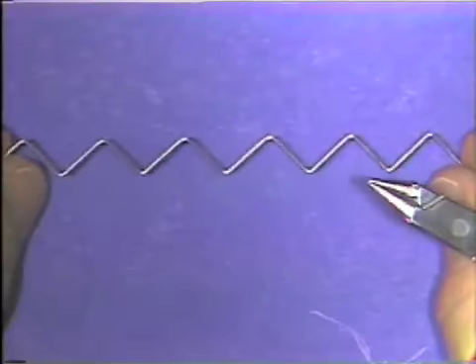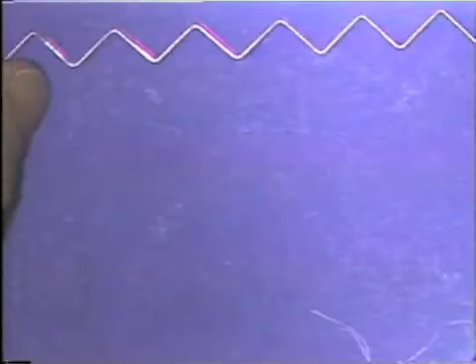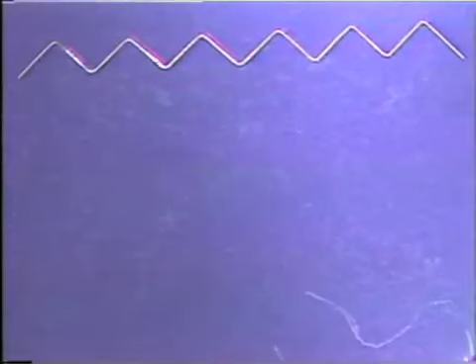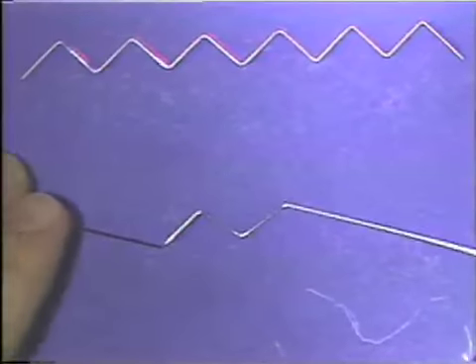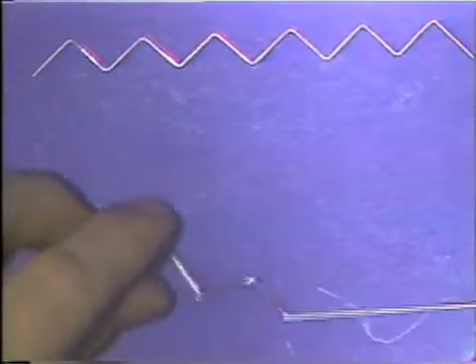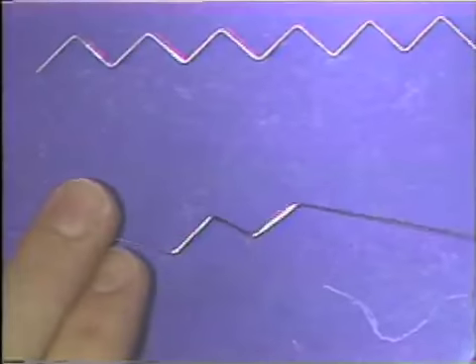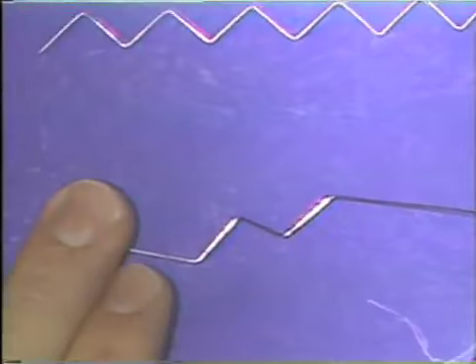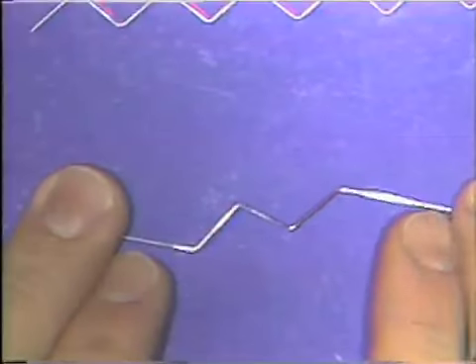It is possible to correct the plane in space of a wire. However, the best example of this procedure is to flatten a wire that is bent out of shape. Now, to flatten a wire, what you're actually doing is adapting it to the flat surface.